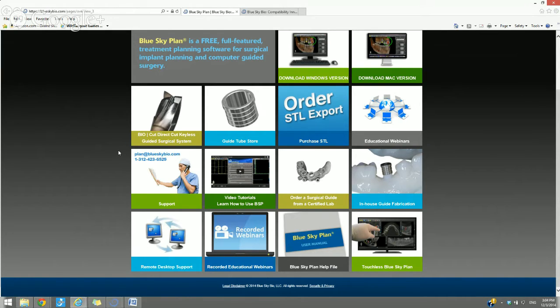We obviously have training that's connected to the software. There are recorded webinar presentations, and as you could see, there are video tutorials. There's a help file that's available here and also in the software. We're very available with any questions via contact information. So really, not only do we have the software that we develop and distribute, but there's a whole system surrounding it to complement and to supplement it.